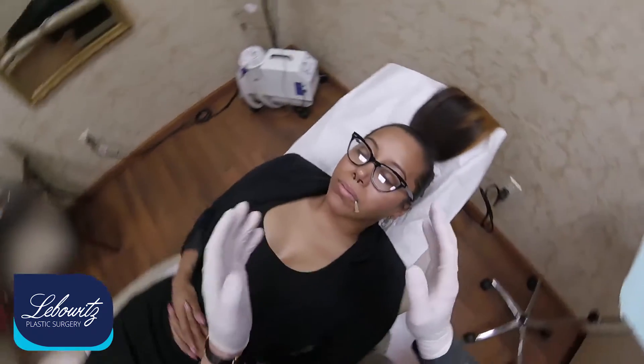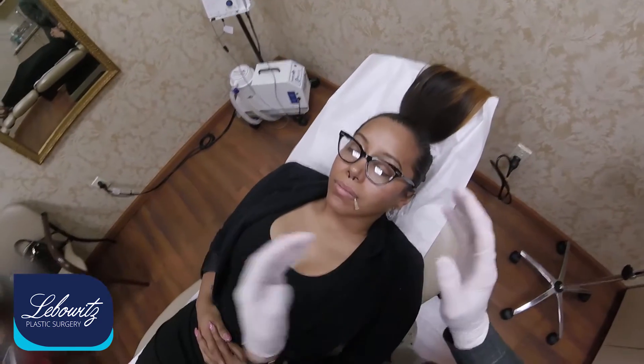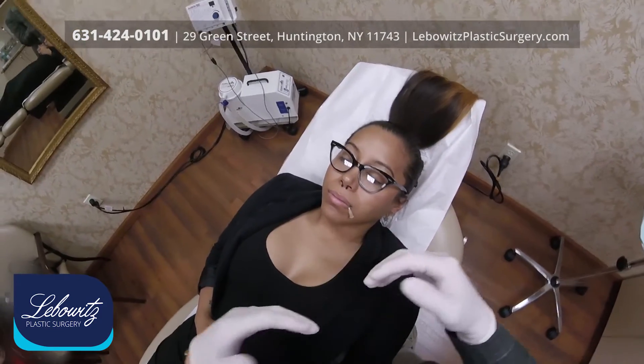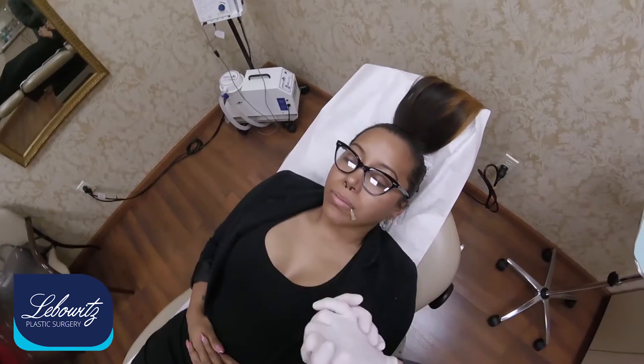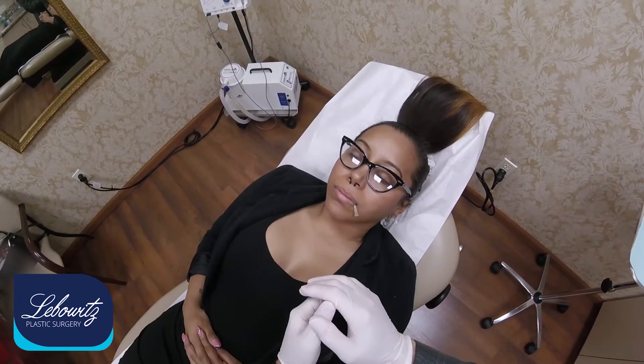Her lips are about even. We're going to do — because she's got nice lips to begin with, but she wants them a little bit more pouty, a little bit bigger. Normally, aesthetically, the lower lip should be a little bit bigger than the upper lip, and she's about 50-50. Normally I do two-thirds of a syringe on the upper lip and one-third on the lower lip, but today I'm doing it 50-50 because she wants to be even on both upper and lower — maybe the lower a little bit bigger than the upper.